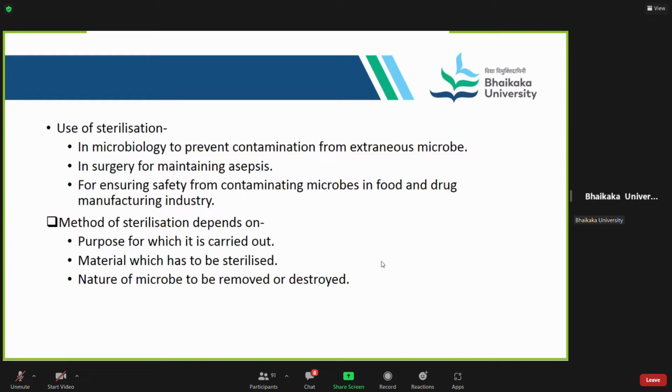And I think when you talk about disinfectants, at the end, you will also come across Spalding's classification, which helps you in deciding what kind of sterilization or disinfection is required for a particular item. Because there are so many things that are used in patient care. They can be instruments like only a BP instrument, thermometer, but you have injectables, you have bed pans.